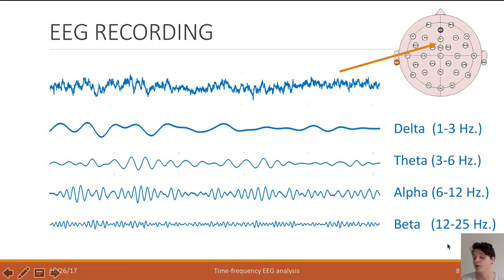There's also gamma waves, which is everything above 25 hertz, which is really, really quick oscillations. And all these waves you couldn't possibly detect with any other method than EEG or MEG. Right? If you compare this, for example, with fMRI, we usually can only find very slow waves because we have to wait on the BOLD response. So they usually can only find waves of 0.25 hertz and lower, and oftentimes it's even lower than that. But apparently all these waves are also apparent in our EEG signal.